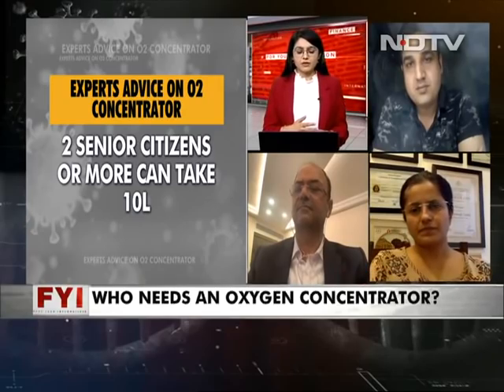Good to clarify that. Also, a quick note over there: in the video and the demo that I did, I used a mask because that is what I had at home at this point. Generally, these concentrators come with a nasal cannula that can be used as well. So you can check what is comfortable to you, and also always take the advice of your doctor. Don't take even what I am saying as a given at this point at all.